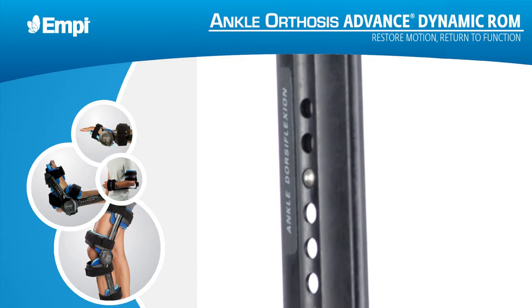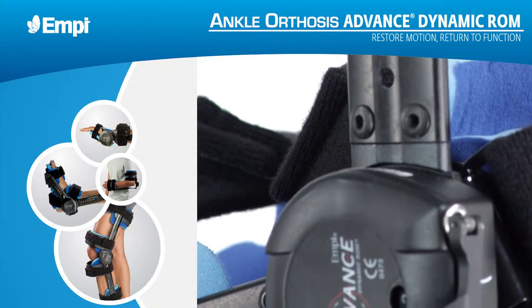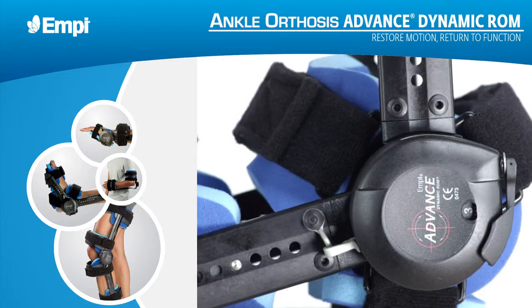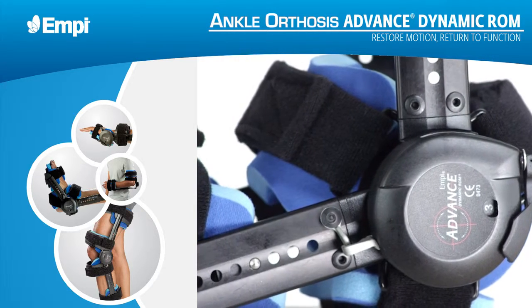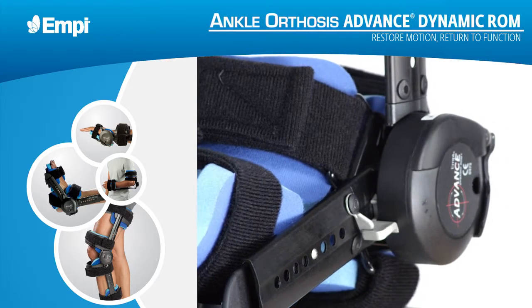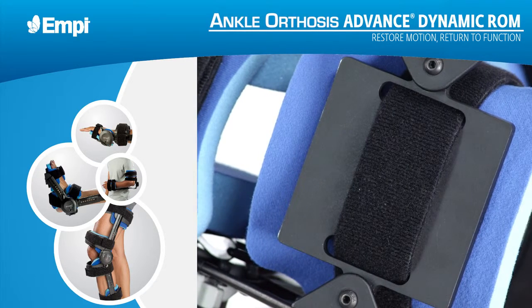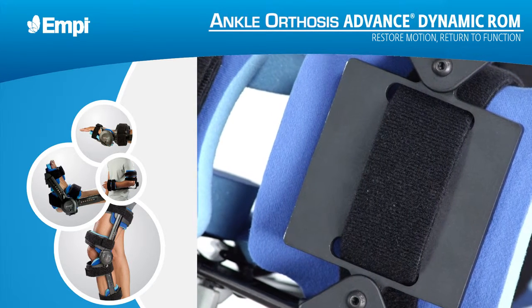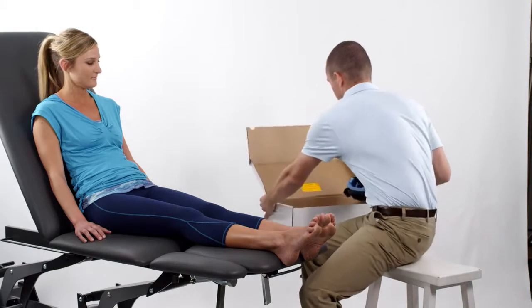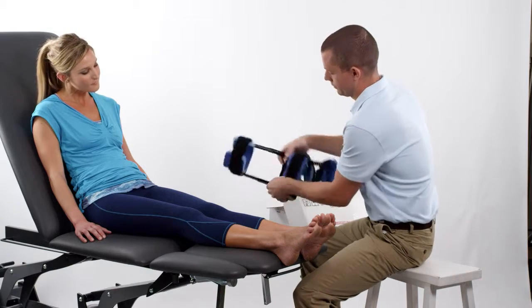The Empi Advanced Dynamic ROM Ankle Orthosis, part of the Empi family of dynamic splinting devices, applies a low-load, progressive stretch to the ankle to help increase a patient's range of motion. The instructions in this video are designed to help ensure that patients receive the maximum possible benefit from their range of motion therapy. After you remove the device from its carton, check the labels on the inside strut to make sure you have the correct unit.